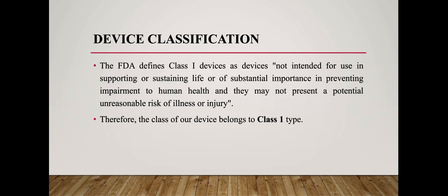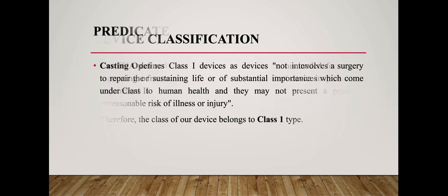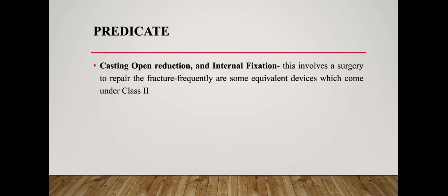Device classification. The classification of our device belongs to class 1 type. Predicate: casting, open reduction and internal fixation. This involves a surgery to repair the fracture, frequently, and some equivalent devices which come under class 2.